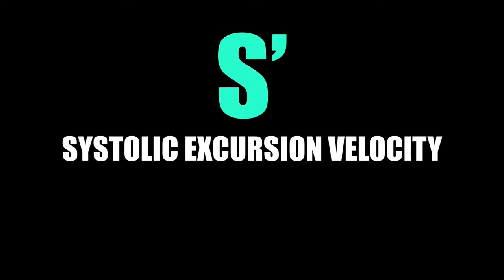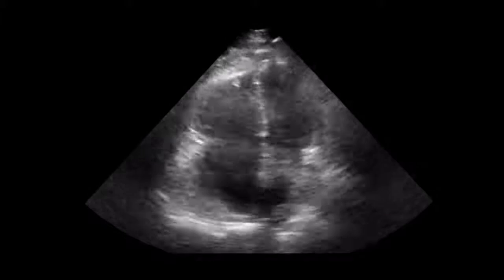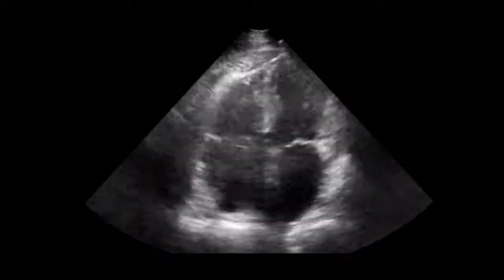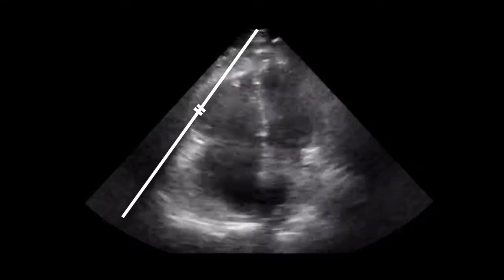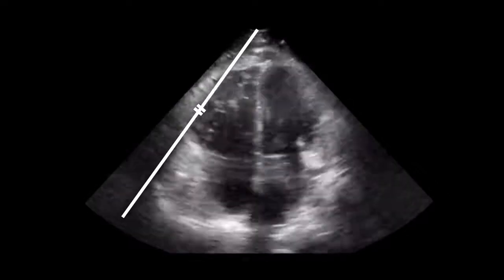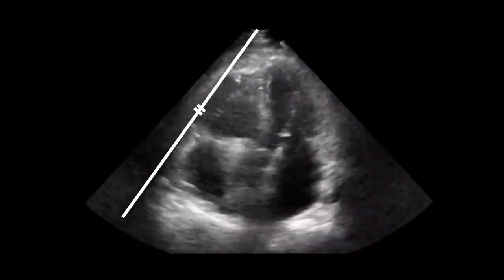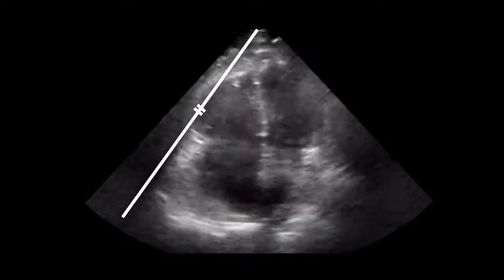Systolic excursion velocity, or S prime, is very similar. You're going to be doing this in the same area as you do TAPSE, but you are going to be using pulsed wave Doppler instead of M-mode. You want your gate a little bit more apical than what you do with TAPSE — TAPSE is basically right on the tricuspid annulus, but you want this to be a little bit closer to the apex.